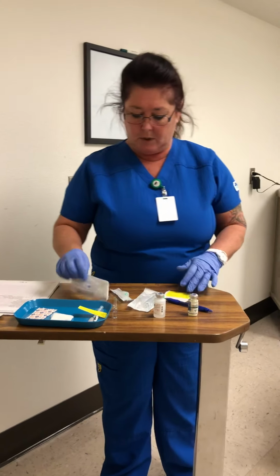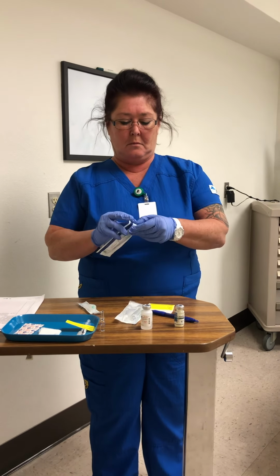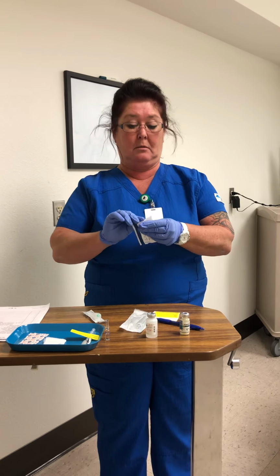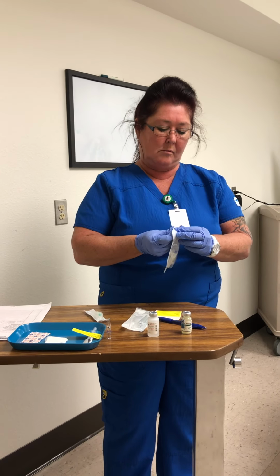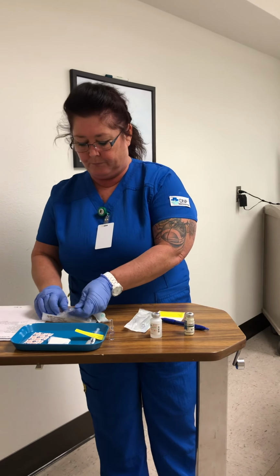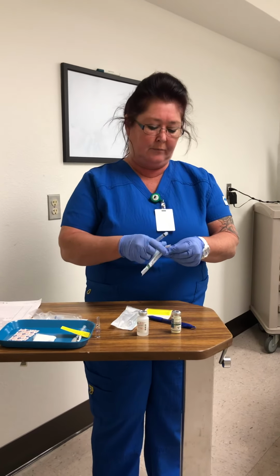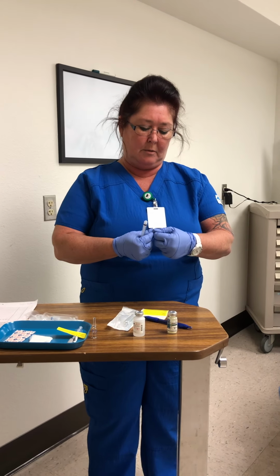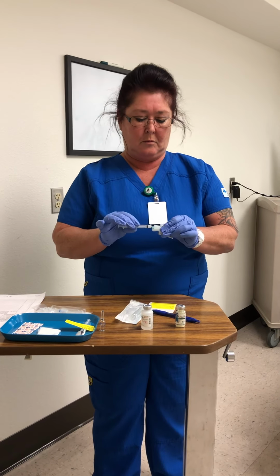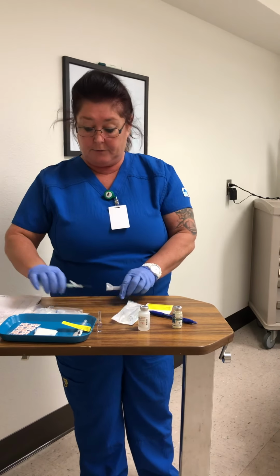Okay, and then I'm going to get my needle. Oh, come on. And I'm going to get my draw needle so that I can mix my sterile water with my powder. I'm going to take the top off carefully.